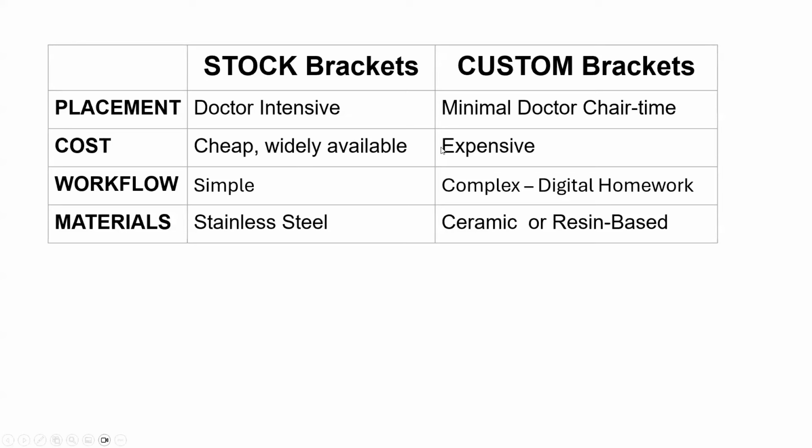Custom brackets are expensive. Workflow: stock brackets, it's a really simple workflow. You order them, you store them, and you pull them out as you need them. Custom brackets do involve digital homework, and so it's more complex and it does take more time on the front end.